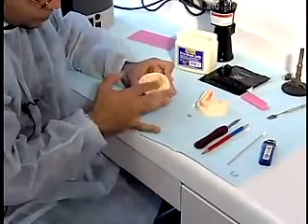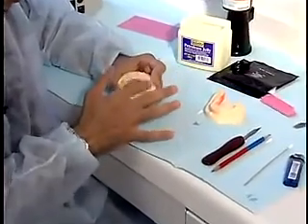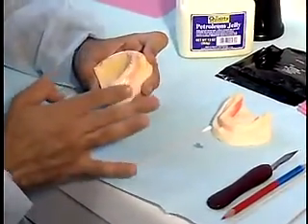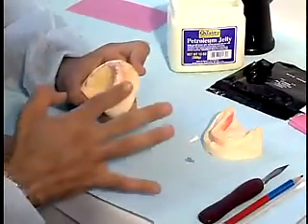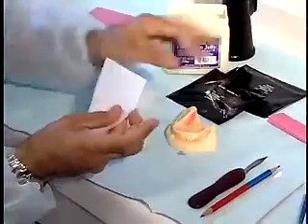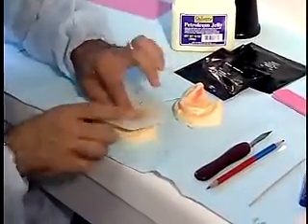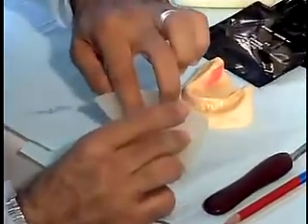Apply a light coat of Vaseline over the entire tissue surface of the cast to serve as a separating medium. Place a sheet of custom tray triad resin in the palate of the cast and adapt the resin gently, moving from the depth of the palate to the borders of the vestibule to avoid trapping air bubbles under the tray material.